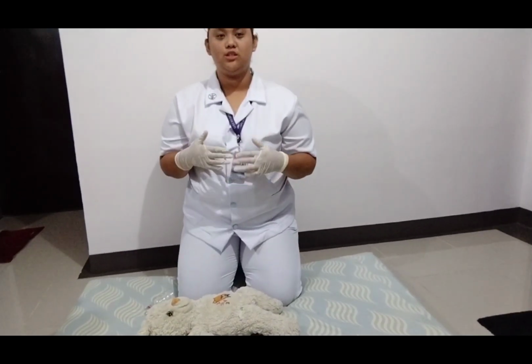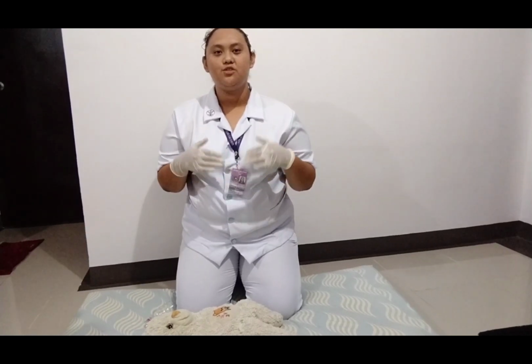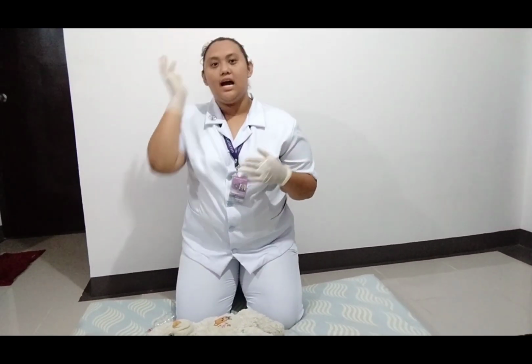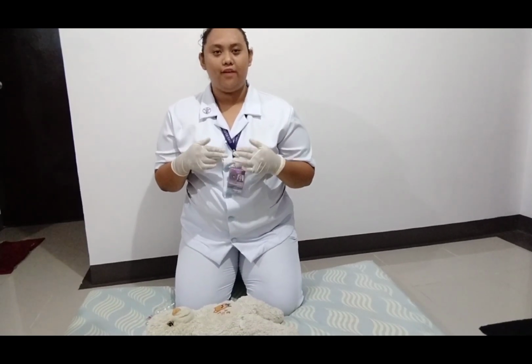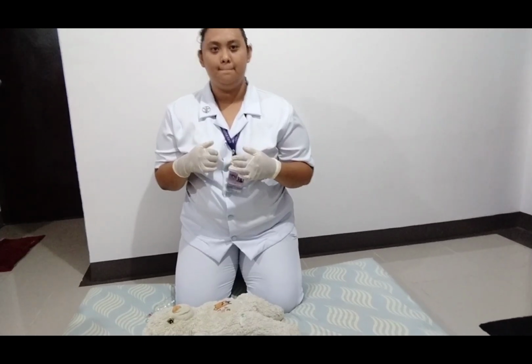Now we'll have to do this compression and rescue breaths until help arrives or until the next responders arrive to take over. Now ensure that in doing chest compressions, there is complete chest recoil and the depth of the compressions is only 1 to 1 and a half inches because we don't want to fracture the baby's bone. Also, for every rescue breath, there should be a visible chest rise.